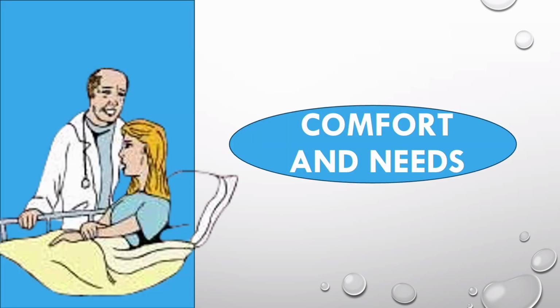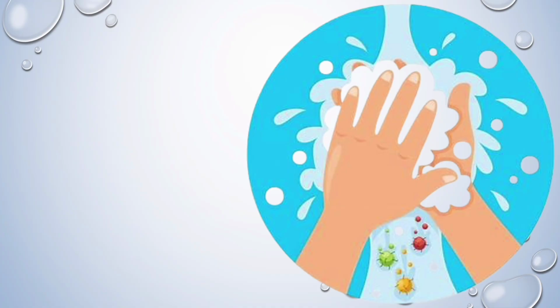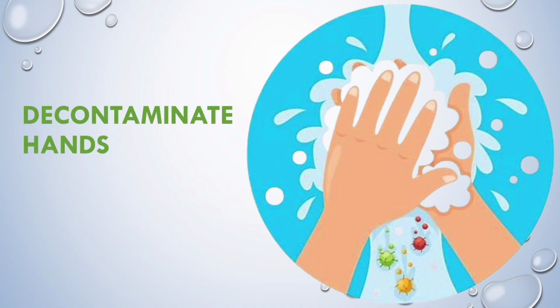Make sure that the patient is still comfortable. Continue to give health education if necessary, and make sure that the patient's needs are met before you finish up. Once done with the procedure, make sure that you decontaminate your hands as part of the infection control policy of your hospital.